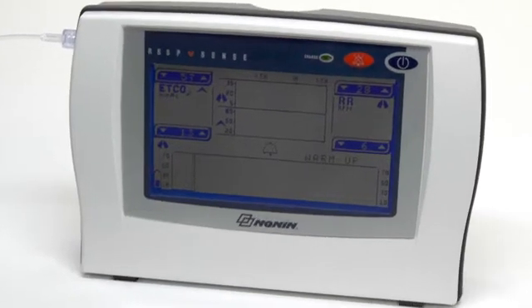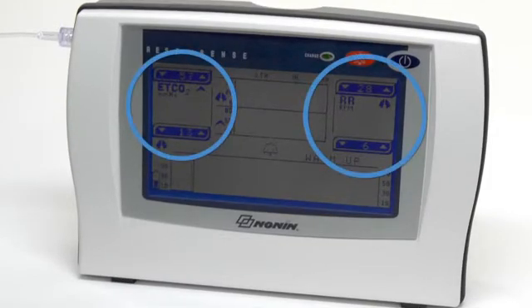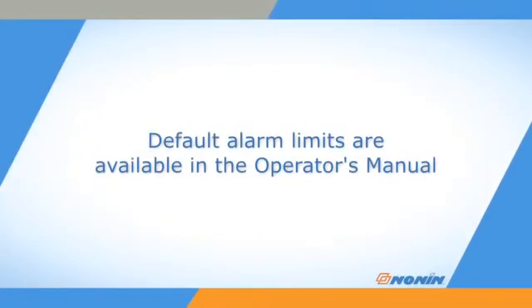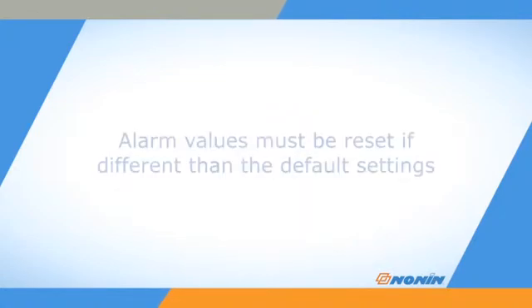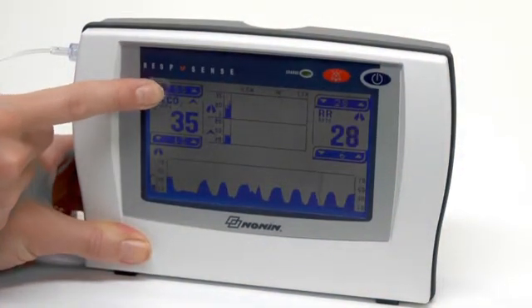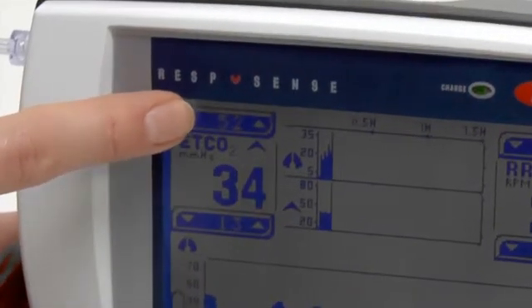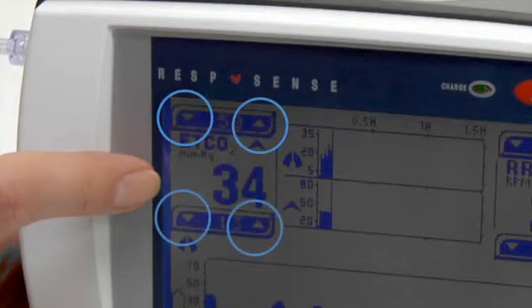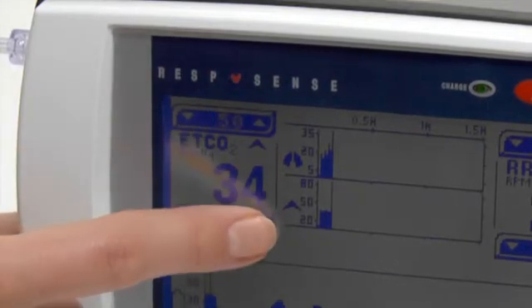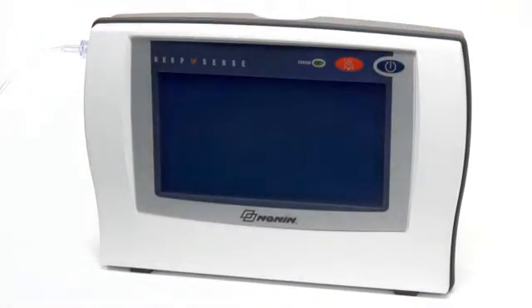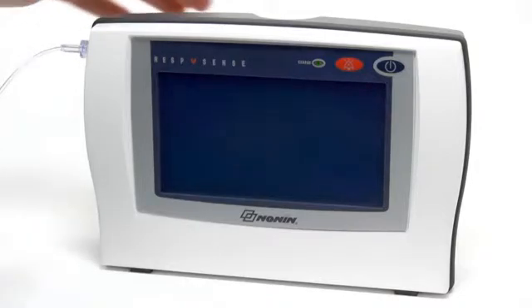The monitor always resets to the default alarm limits for your selected patient size at power-up. The default alarm limits are available in the operator's manual. You must reset the alarm values to your chosen limits if they differ from the default settings. Limits are easy to reset — simply press the up or down arrow in the bar next to each value to scroll to the desired value. Remember, if you turn the monitor off, alarm settings will return to the default limits at the next startup.